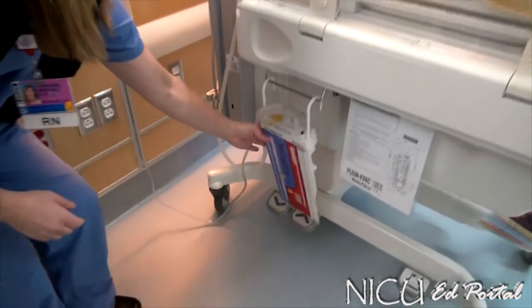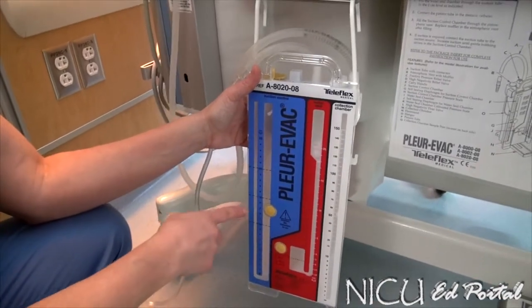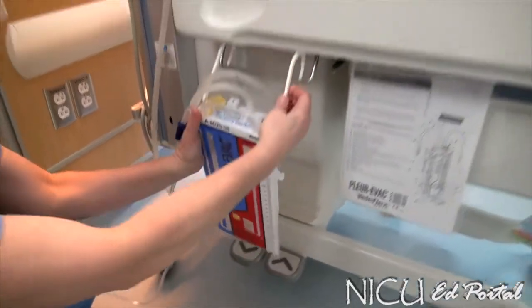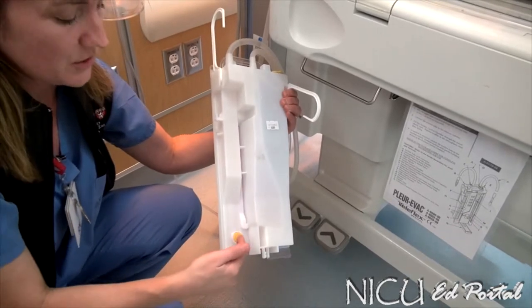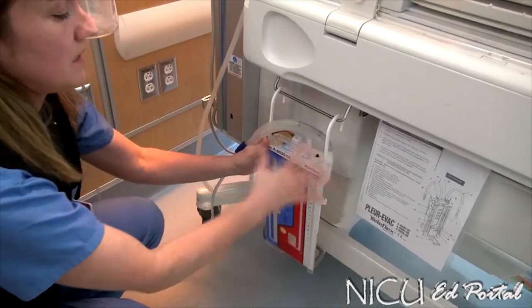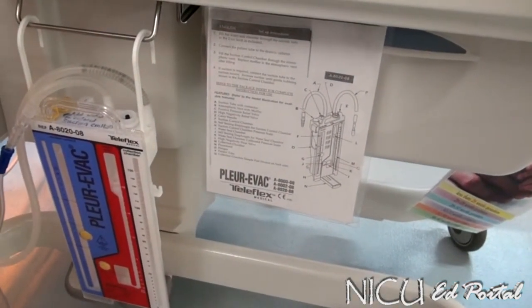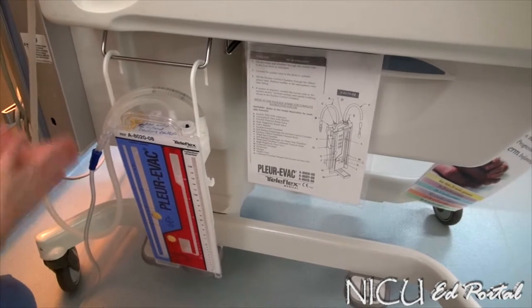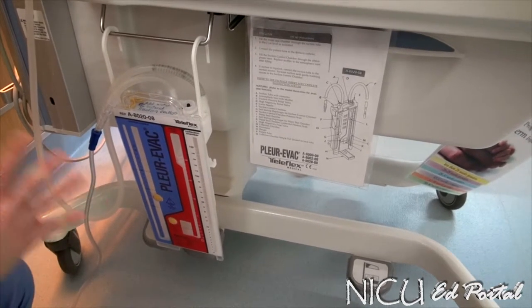In this system, due to evaporation — if the baby has this unit on for a few days — you can actually either inject more water or pull off if you happen to put too much in. You also have a place in the back where you can draw labs if you need to send fluid off to the lab. With the unit there's an insert that tells you what each part is, found within the unit package when you open it.